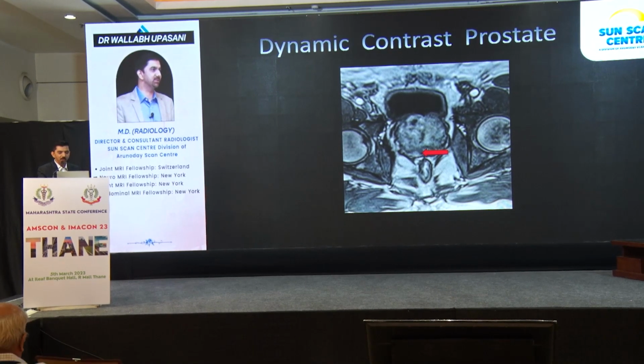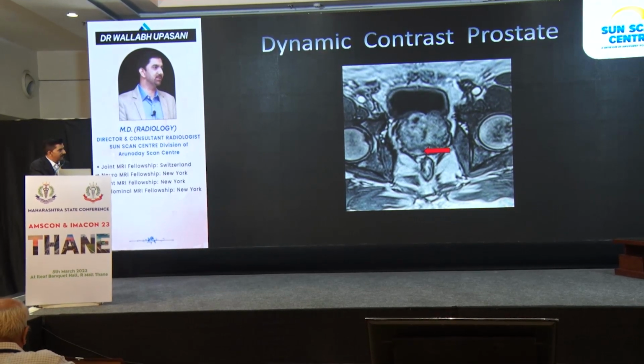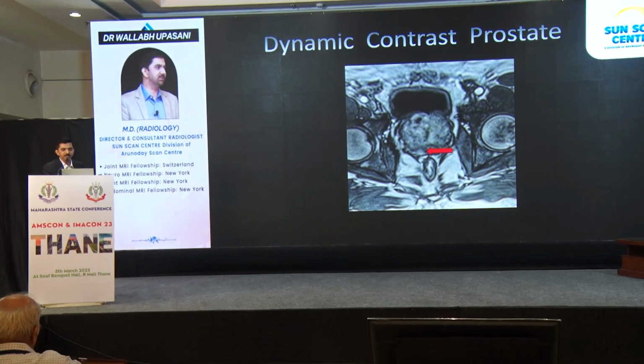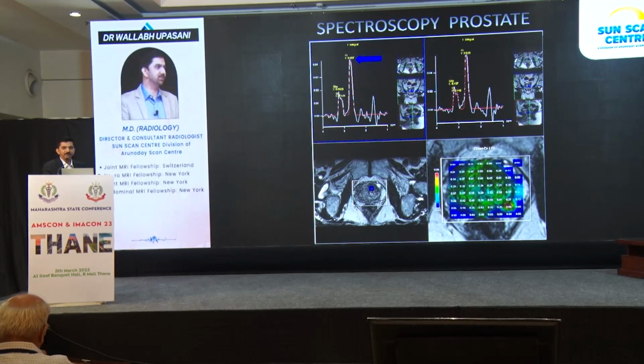And we do a dynamic contrast, and if you can appreciate that this area is bright and it has absorbed the contrast. So this is a malignant lesion. What else can we do? We can do an MR spectroscopy.